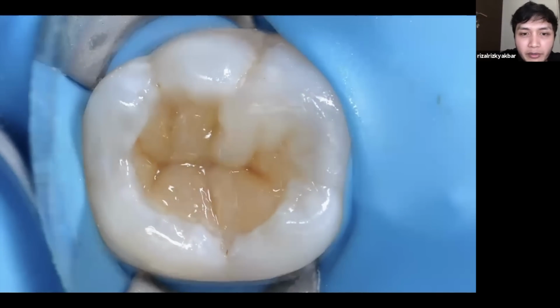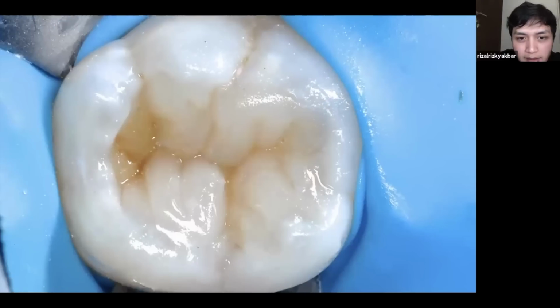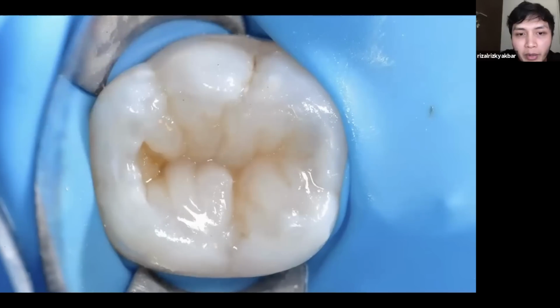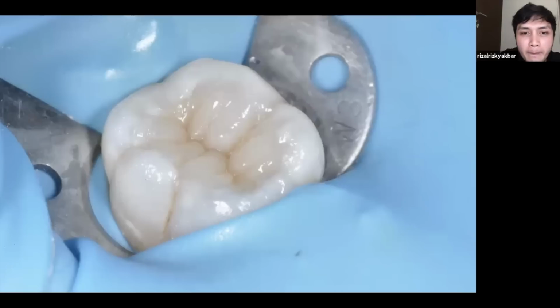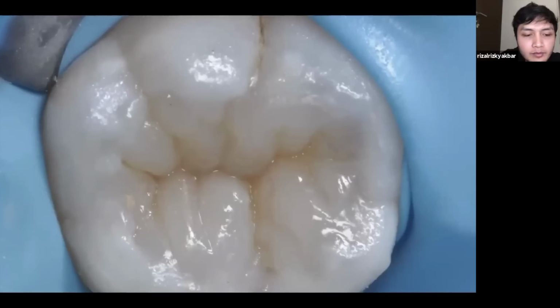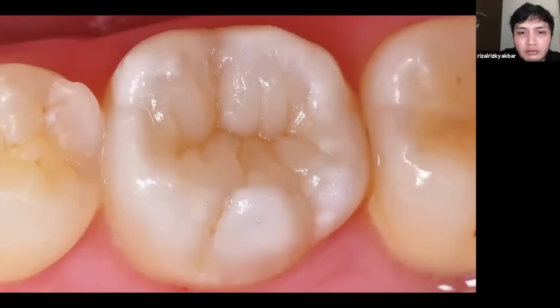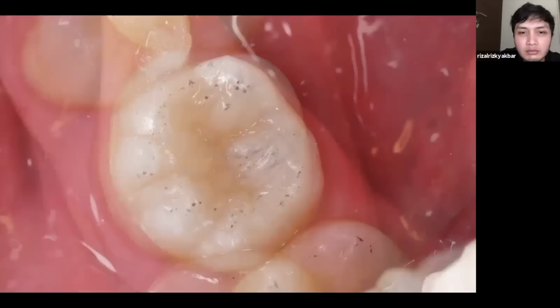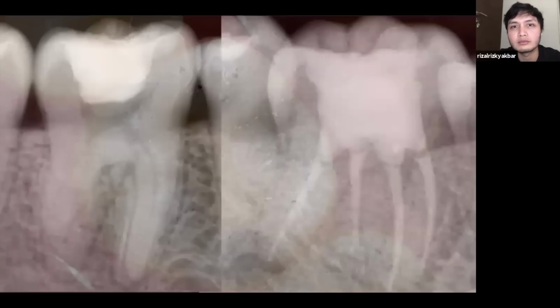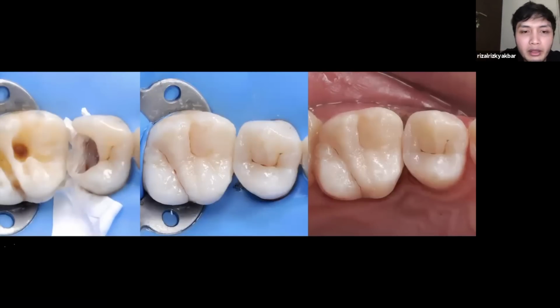We'll talk about internal stain first. So basically, you create a mapping in the dentin layers, and then you put the stain, and then you can use that as a guidance for you to place the enamel layer by layer. So internal stain can be a guidance for you to create the enamel, the last layer.